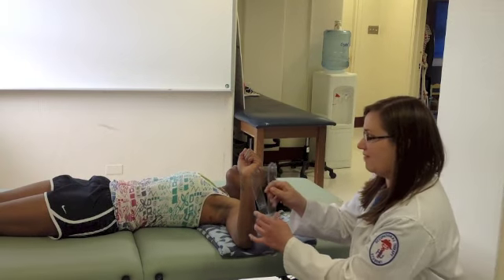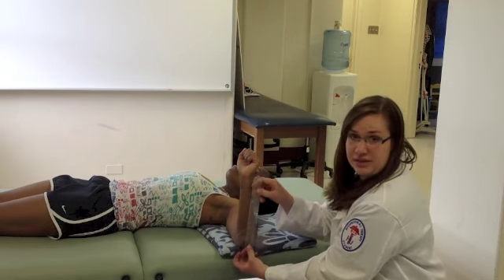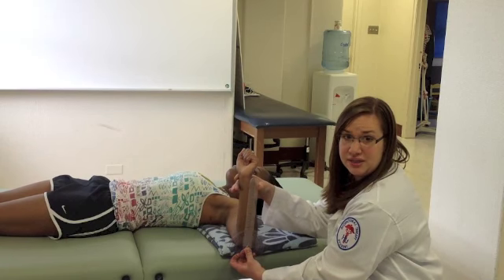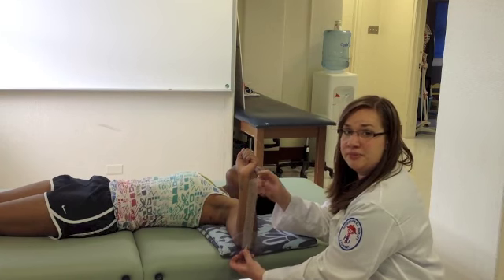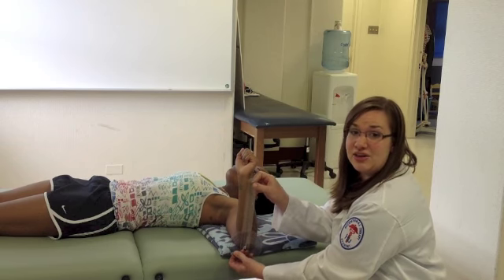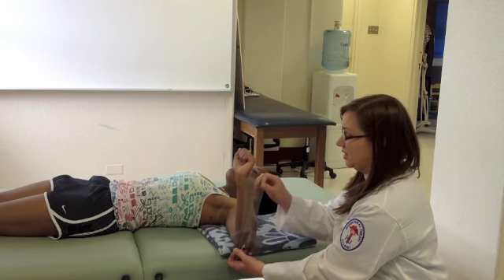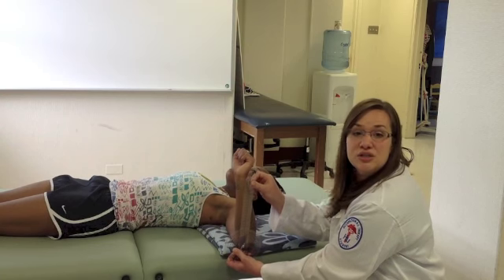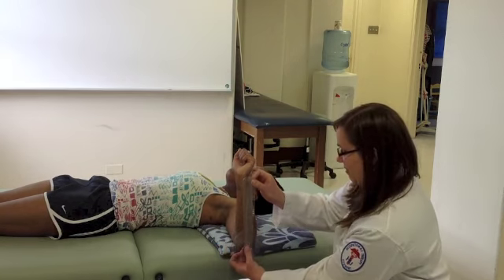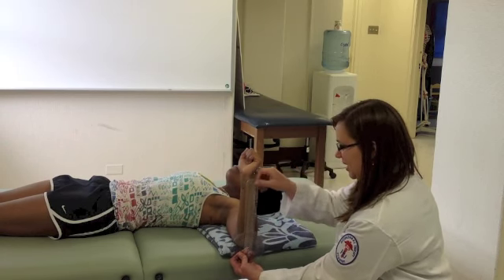So then to measure the range of motion, I'm going to have the axis of the goniometer at the olecranon process of the ulna with the stationary arm perpendicular to the floor, and then the movable arm parallel to the longitudinal axis of the ulna and pointed towards the styloid process of the ulna. So first, we will have the patient move in that same position, moving your hand towards me.